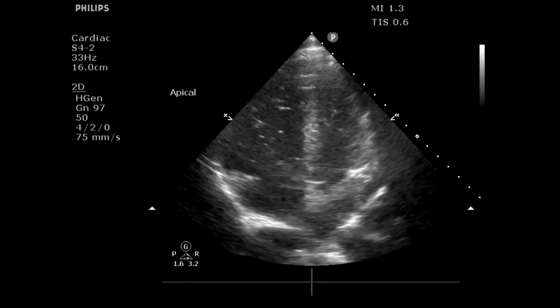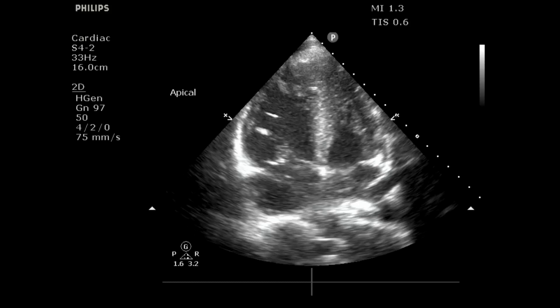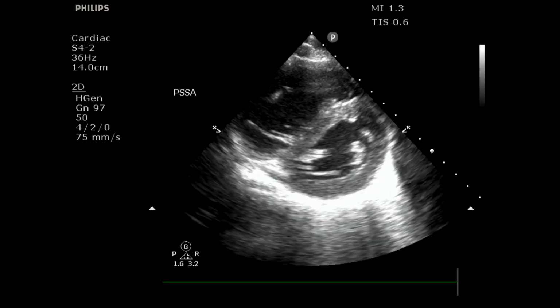And so this, in the context of cardiac arrest and ROSC, should bring up one major thing, and that is pulmonary embolism, right? And we can see in our short axis window, right there, we definitely see a flattening of that septum, which further seals the deal for that RV strain, suggesting that the RV pressures are significantly higher than they should be at this point. So this patient has a pulmonary embolus, right? And when they went to CT scan, that's exactly what was found.